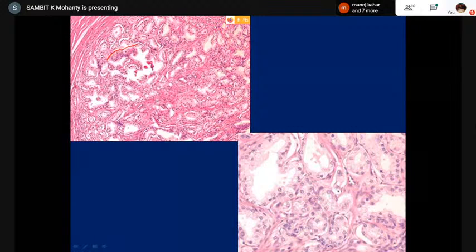This one is a benign lesion with dark nuclei, and you can kind of draw a circle surrounding this nodule. So this is a non-infiltrative small acinar proliferation with some glands next to each other. They are really not infiltrative. And here, this is a benign gland.